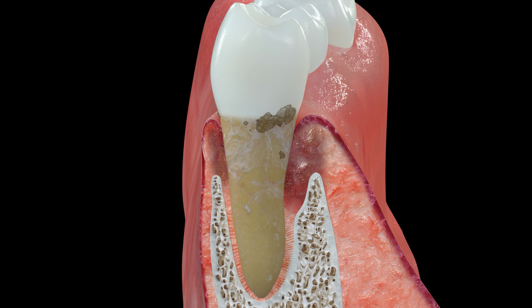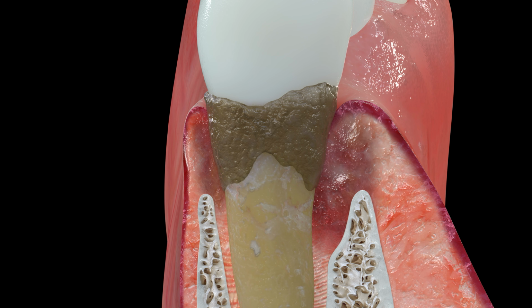In deeper periodontal pockets, presence of hard biofilm or calculus can prevent the probe from reaching to the depth of the pocket, giving an under-measurement reading.